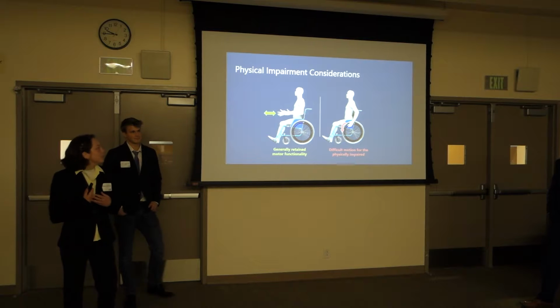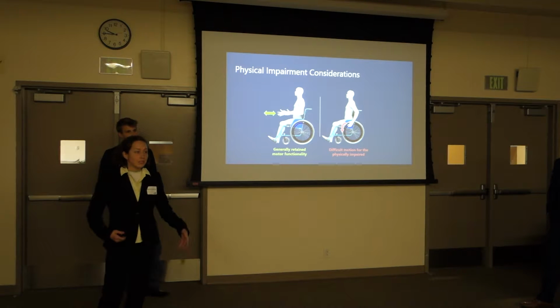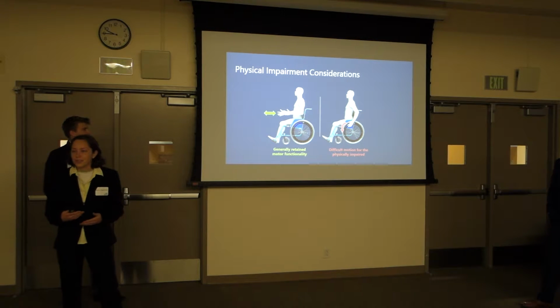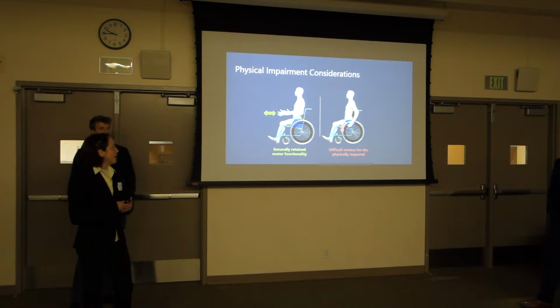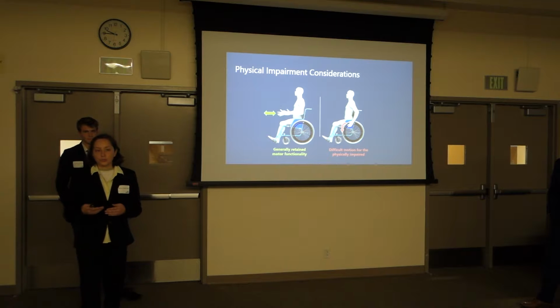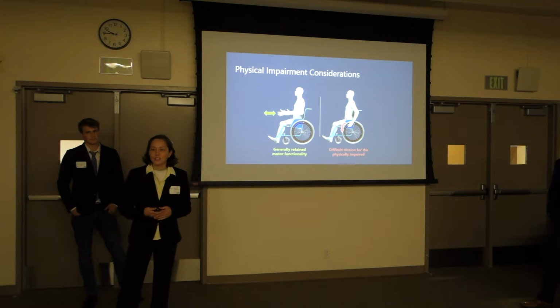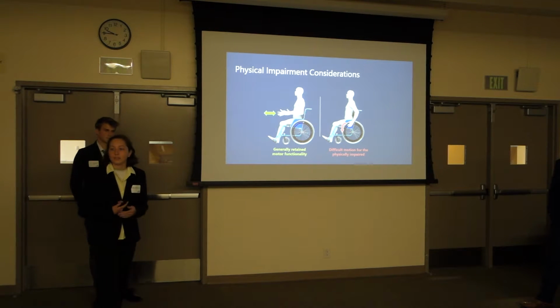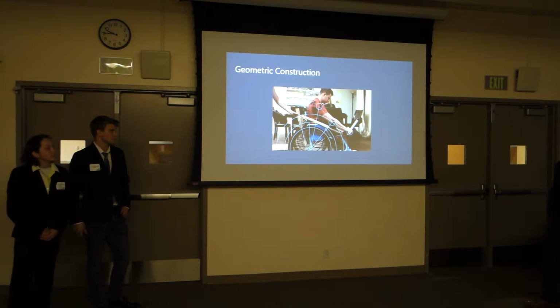Patients who have a stroke or other injury that leaves them with muscle degeneration can't always reach or hold on to a push rim from a wheelchair and propel themselves forward with it. So this leaves them to use other unconventional ways of moving forward in a wheelchair, such as pushing along the floor with their feet. And this does not allow for any rehabilitation of the muscles or the lost movements. It often forces patients to put their mobility as a priority over their rehabilitation. We wanted to take advantage of the movements that patients generally retain from these injuries in the design of Mpowrd. Of course, it would be terribly energy inefficient for someone to try to propel themselves with just one arm, and you would have the tendency to go in a circle.